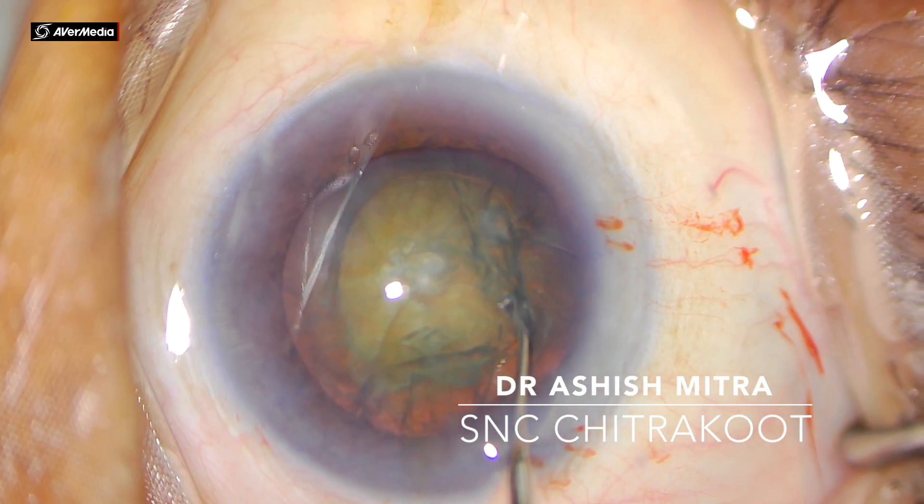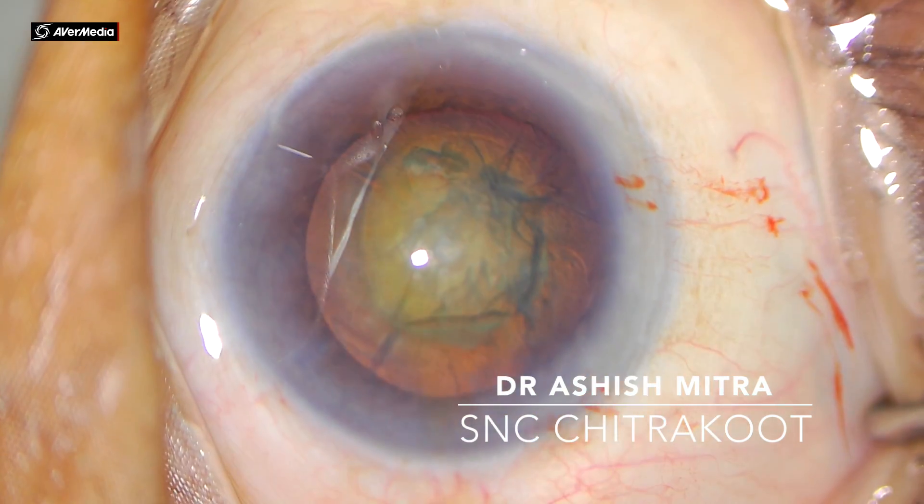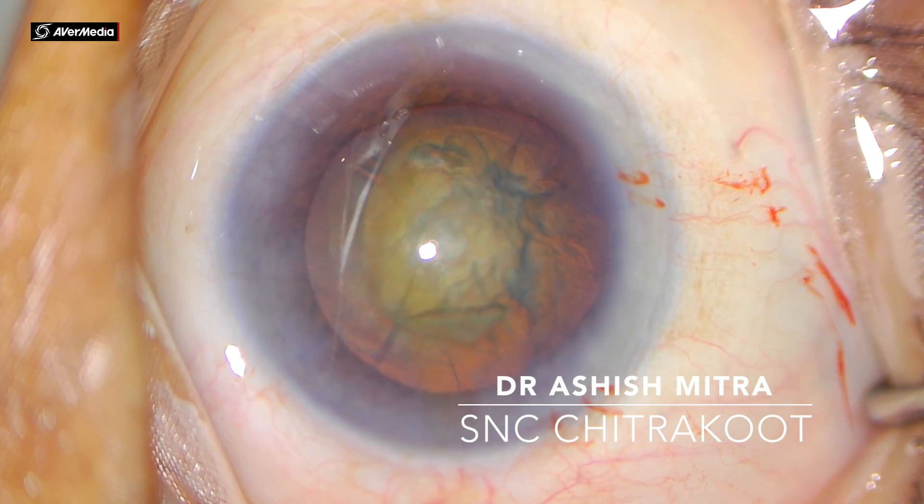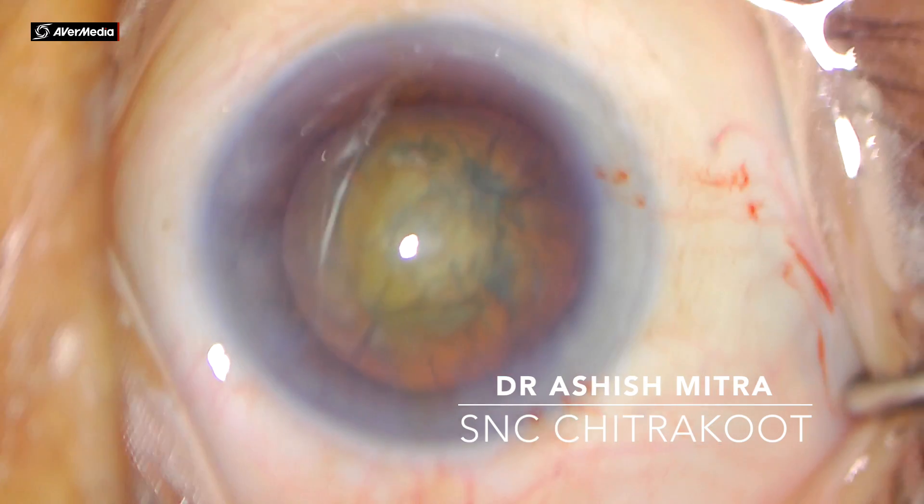Engage the nucleus and gently rotate. I will demonstrate again — engage and dial. See how nicely it is rotating; that means my hydrodissection was adequate.